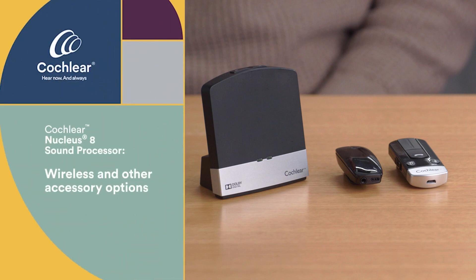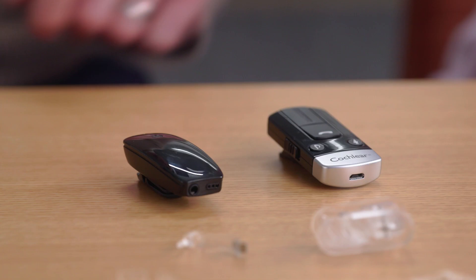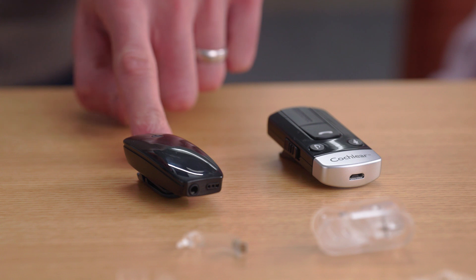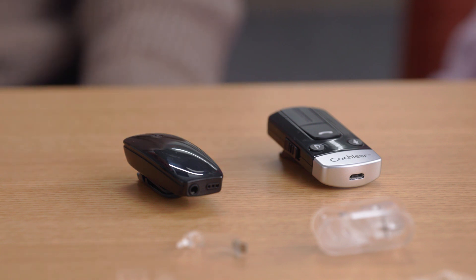Now we'll review the additional wireless and other accessory options available. Your kit may include one or more of these options depending on the selection by you or your audiologist. While many of our recipients enjoy streaming from their smartphone with our direct connectivity feature, there may be situations where you want to talk on the phone hands-free. Cochlear Phone Clip makes it possible to talk hands-free while driving or hear through other compatible Bluetooth devices. The Cochlear Wireless MiniMic 2 Plus is a helpful tool for situations where you may want to hear someone at a distance, such as a lecture hall, a classroom, or noisy situations like a restaurant.